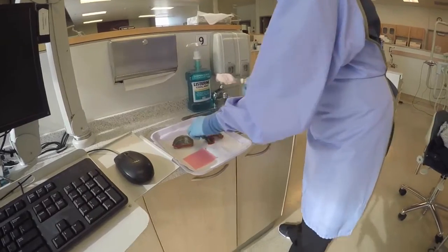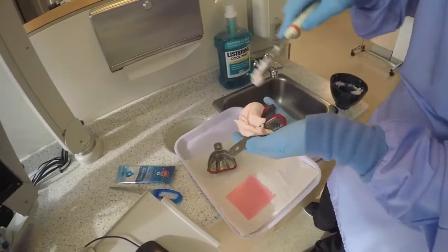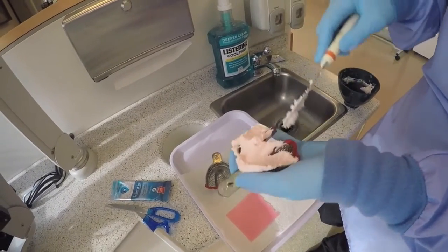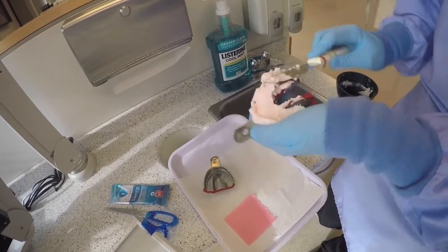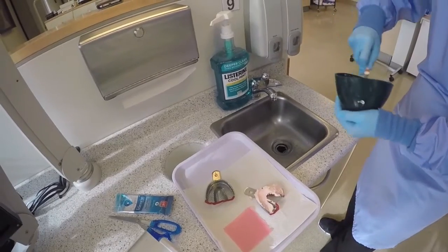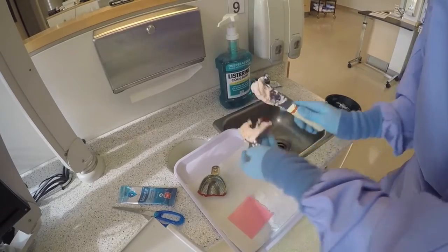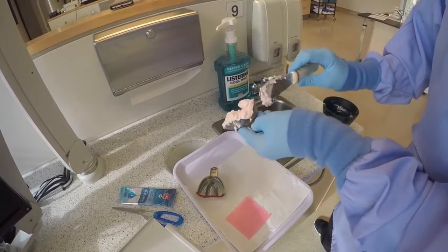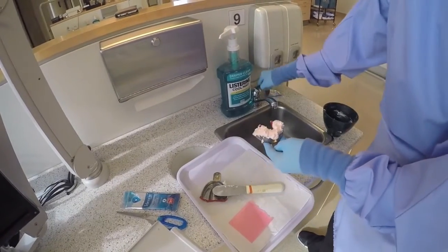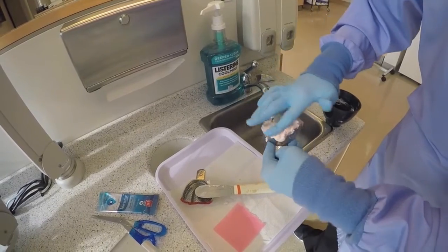Once your material is completely mixed and is a frosting-like consistency, use the spatula to load the mandibular tray from the anterior portion first. Then, wet your finger to smooth the surface using cold water.